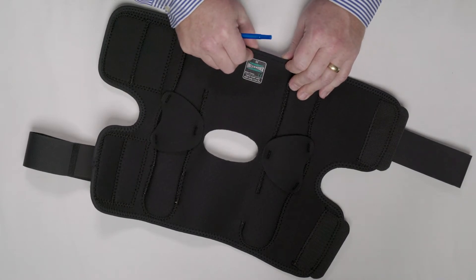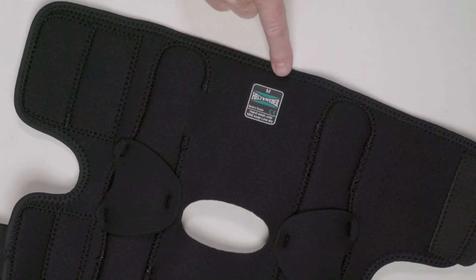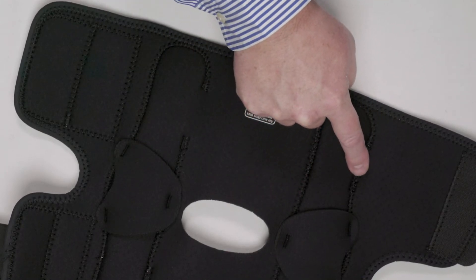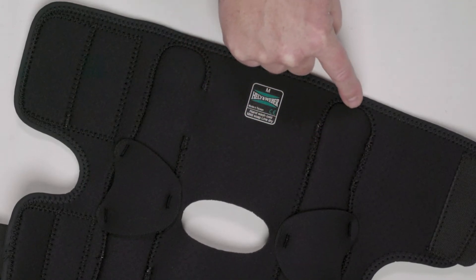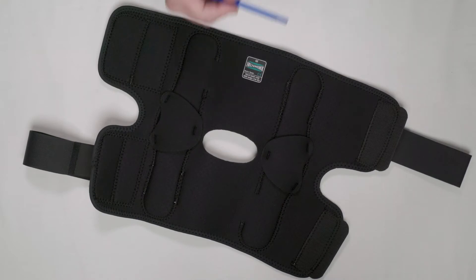Stitching quite literally makes the brace. Most braces are made with a zigzag stitch — well, we use the zigzag stitch too, but where others end and put it in the box, that's just where we begin. The second thing we do is use a very tight zigzag, especially around the hinge pockets. We tighten the stitches up considerably for significantly more strength and durability.